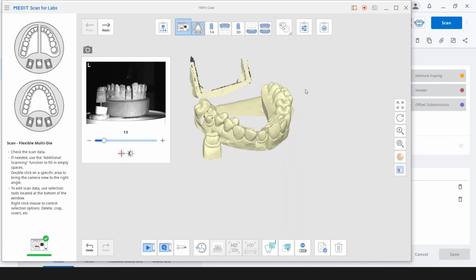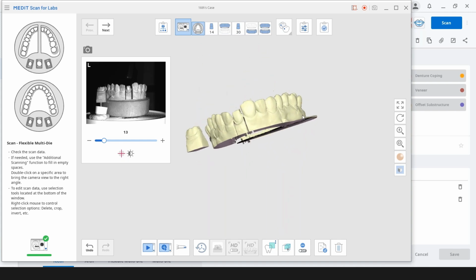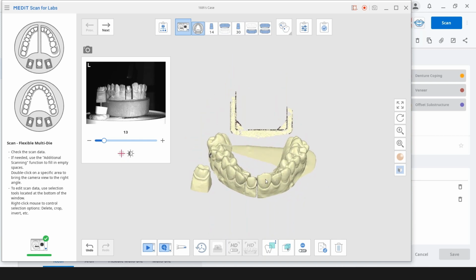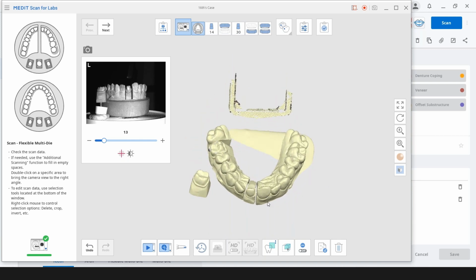So in this stage, a fast moving lab that doesn't want to waste time would just move forward from here. For demo purposes, I'm going to show you this, and just because I like to have neat scans anyway, I have the time, so why not? So you move down here, you have these selections to trim with. This is for drawing any shape around an object. These are just rectangular, square type of box deletions or cropping. And these are for islands. So if you have floaters out there, you can click on them.